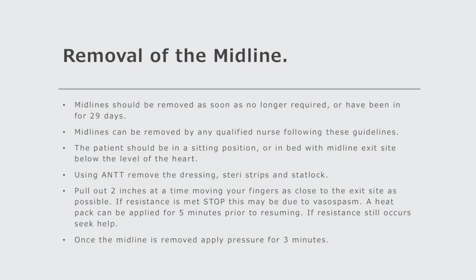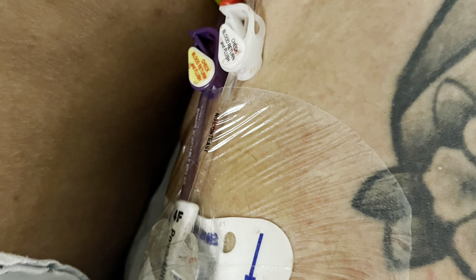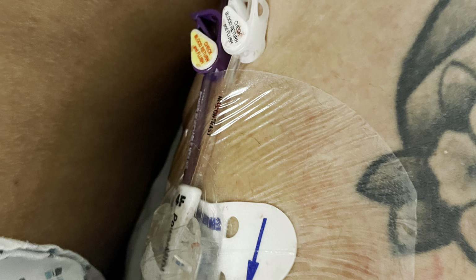Midlines should be removed when they are no longer required or if they have been in for 29 days. They can be removed by any qualified nurse following these guidelines. The patient should be in a sitting position or on a bed with the midline exit site below the level of the heart. Using an ANTT, remove the dressing, steri-strips and stat lock. Pull out 2 inches at a time, moving your fingers as close to the exit site as possible.